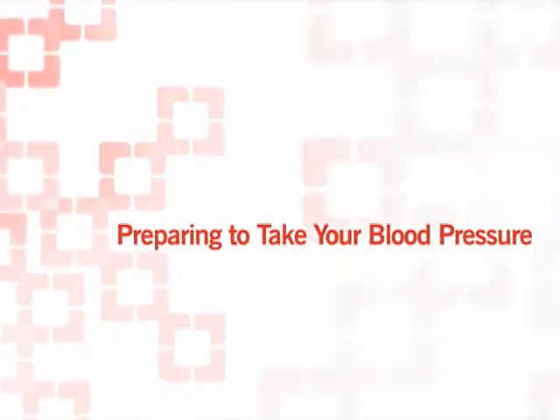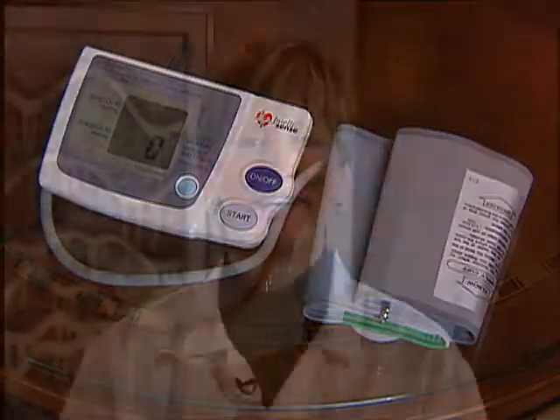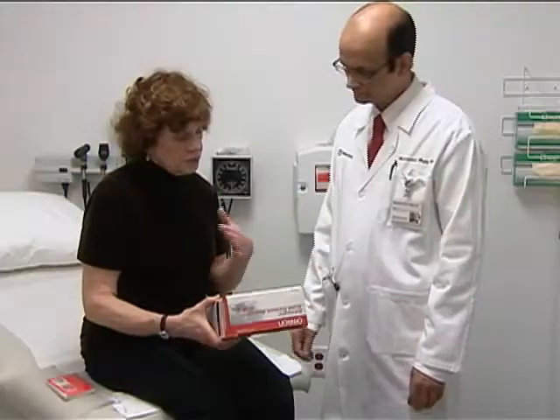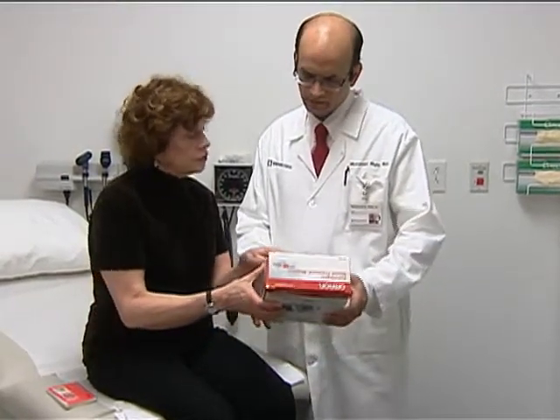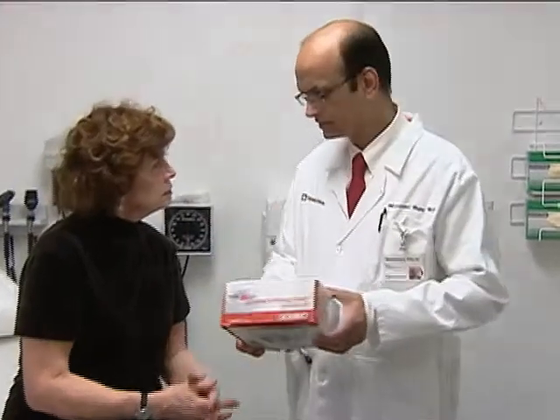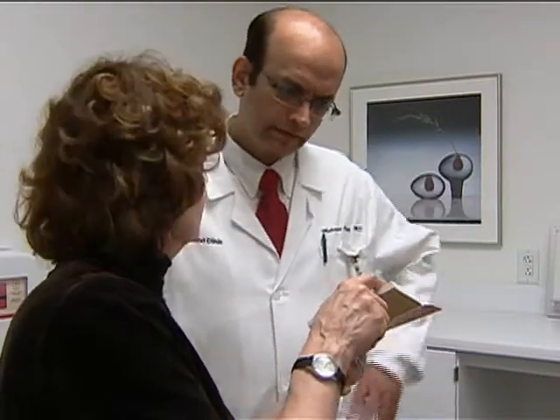When you are purchasing a blood pressure measuring device, bear in mind that devices that use arm cuffs are the most reliable, making them the best for measuring blood pressure. Also, make sure that the blood pressure cuff size is right for you and that it fits properly around your upper arm. After you purchase your device, bring it to your doctor's office so the doctor can make sure it is working properly. You should have your doctor check the device once a year. You should also ask your doctor how often you should check your blood pressure.